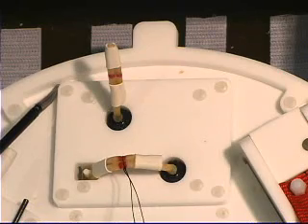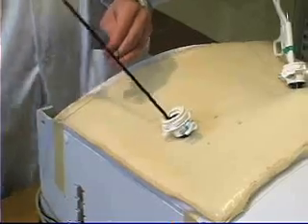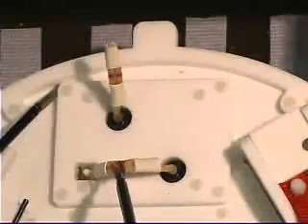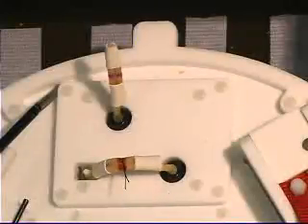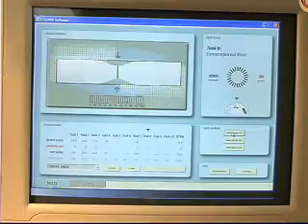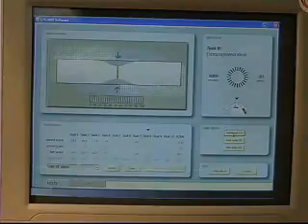Once 2 hitches are thrown, the suture is cut. The task is considered complete if the tension within the tube is maintained for a total of 3 seconds. 50 points are assigned to a knot placed outside of the target area, and a score of 0 is assigned if the 3 seconds of tension are not maintained or if the knot slips.